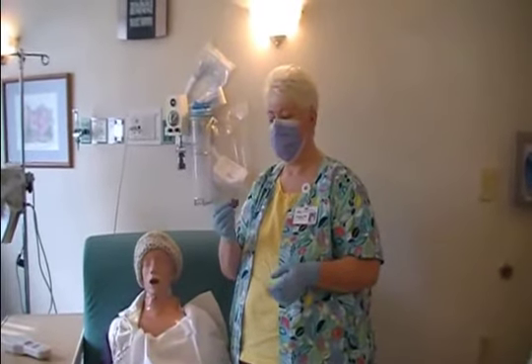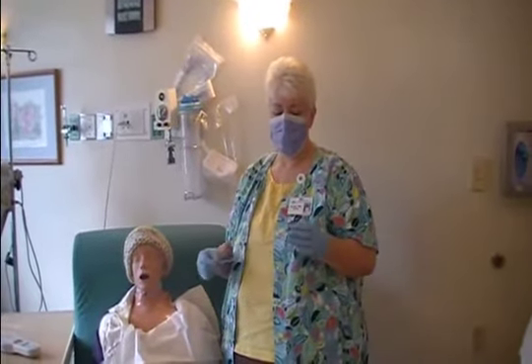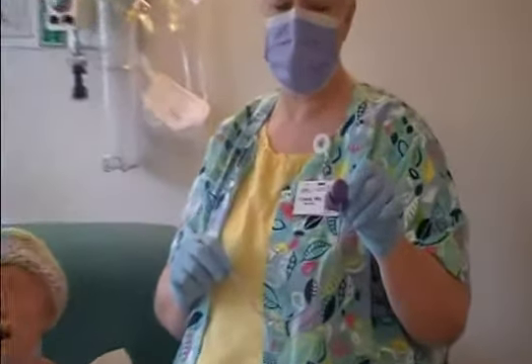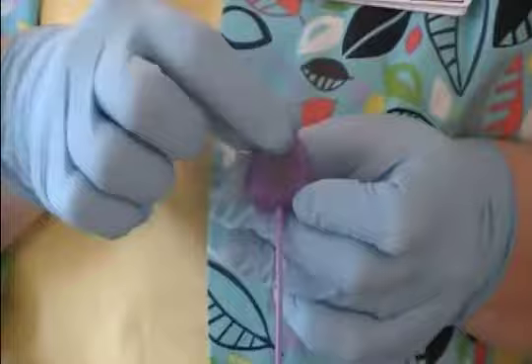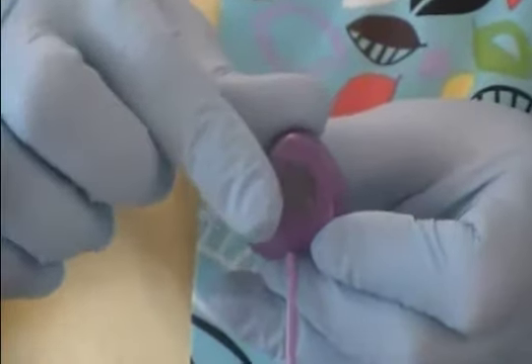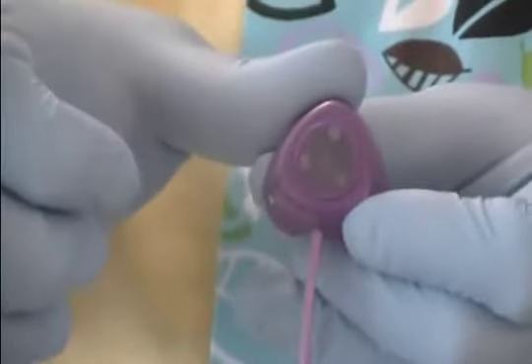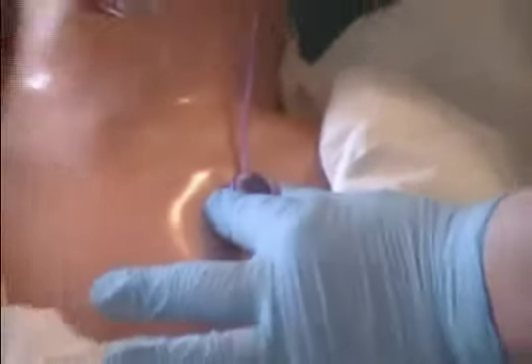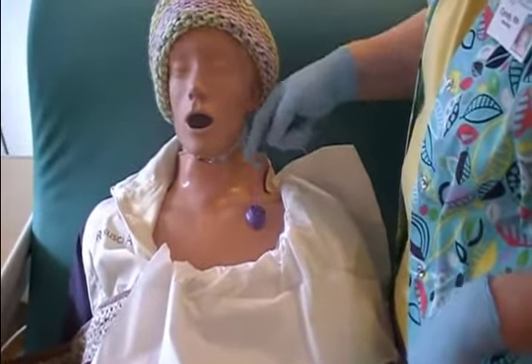Hi, I'm Cindy Sewell, and I'm going to be showing you about accessing the Purple Power Port, or any port, but I wanted to show you the kind of port that we place here at this hospital. It's called the Purple Power Port, and it is cleared for CT scans. It is a high pressure port. It does have three triangles on it, which helps you know that it is a Purple Power Port when it's under the skin. It also helps you locate the inside of those three triangles, because that's where most of the access area lies. It gets placed in the chest, about in here, and it goes up underneath the clavicle and up into a major vein and down into the chest.